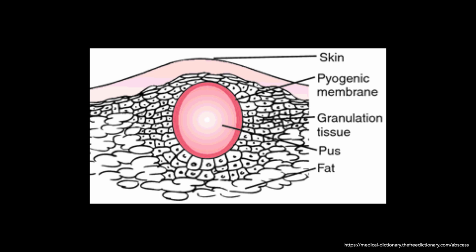Now, surrounding that, you're going to have a bunch of inflamed tissue. They call it the granulation tissue. I'll show you a picture in a little bit with some color overlays, but I like to call it the inflamed penumbra, right? Some other terms you can use is the phlegmonous portion of it. The phlegmon is the inflamed stuff that's going to become necrotic, but is not yet necrotic, right? And then as we extend out, these different radiating spheres moving out from the core, we get to eventually more normal, non-inflamed tissue. And so let's move on over to the ultrasound, and we can see how these findings can be replicated on our ultrasound machine, right?